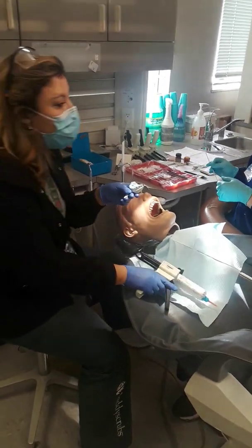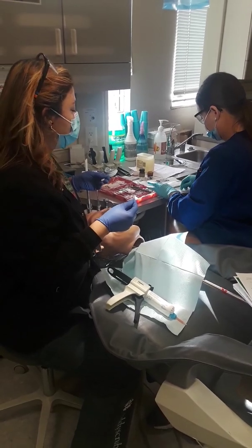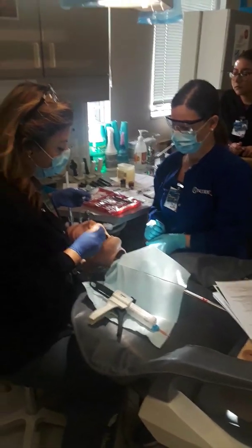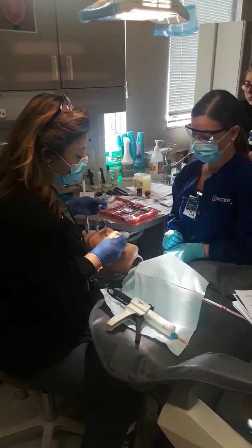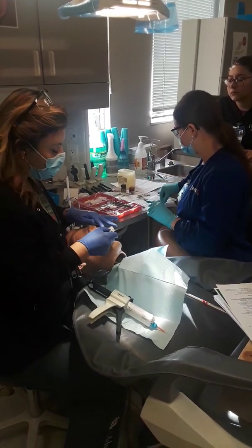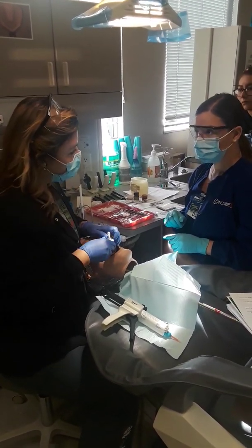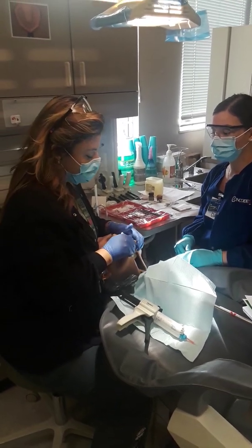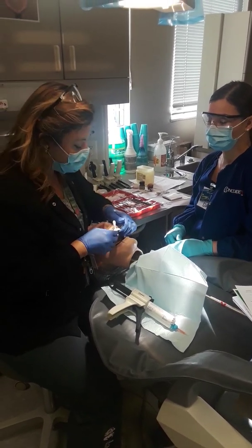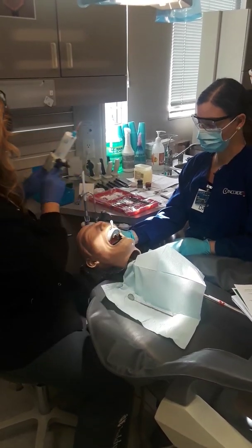But the way we're going to learn here is the old school way, mixing powder and liquid, so you know how to do it in case you don't have this on stock. So we're going to Vaseline the tooth, because if you've done a build-up, they will bond together. So you always want to make sure that your patient will be biting. In his case, it's kind of hard for him to bite, but the patient should be biting. We'll wait for this to get hard.